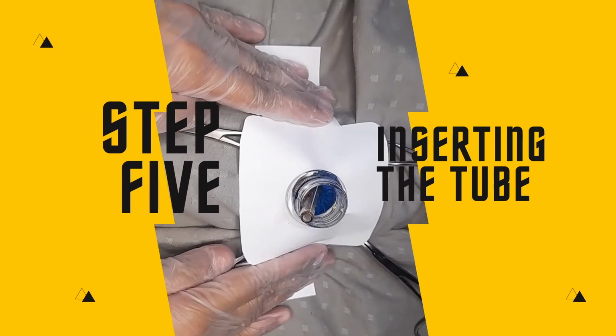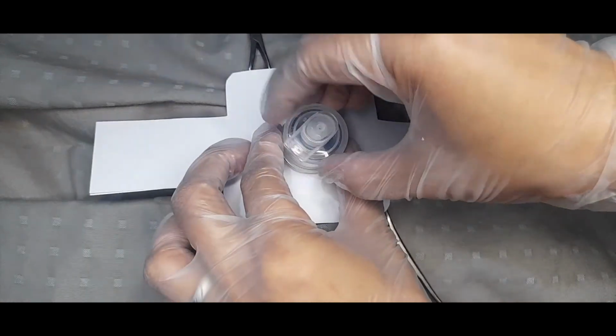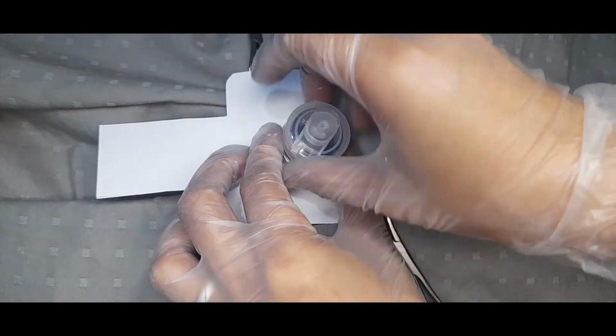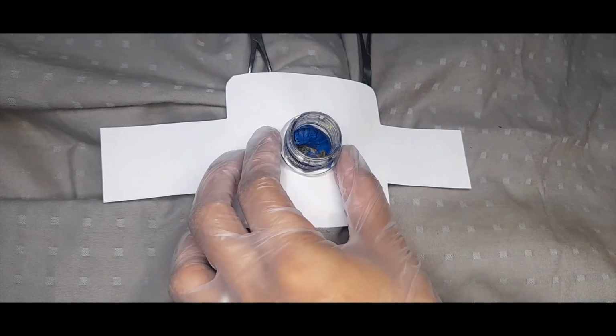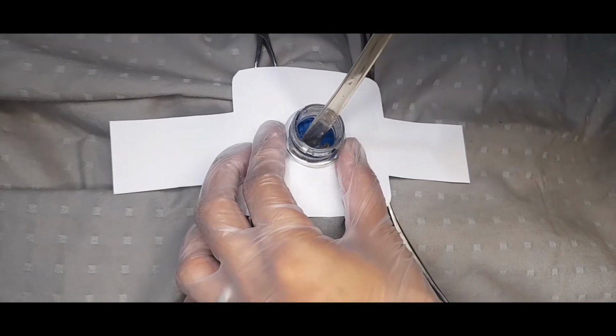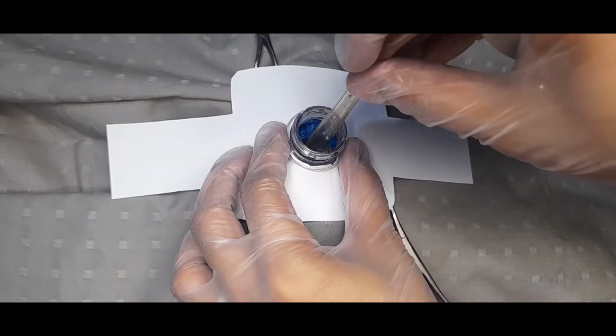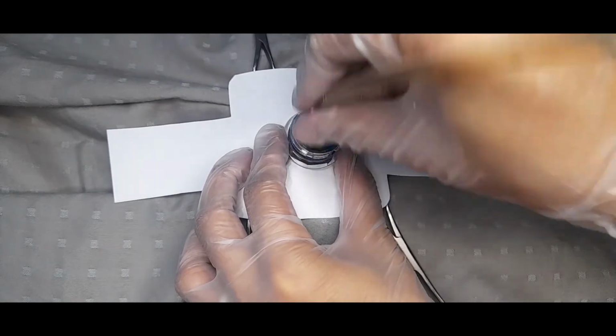Step 5. Inserting the tube. Then insert the tracheostomy tube into the tracheostomy atraumatically so that it comfortably sits in the tracheal lumen.